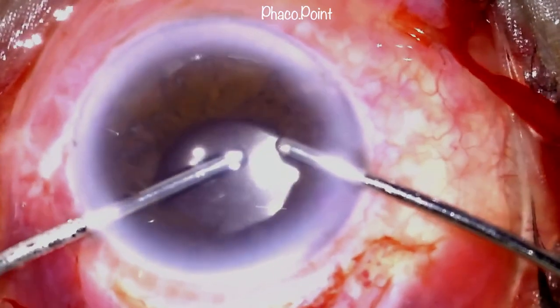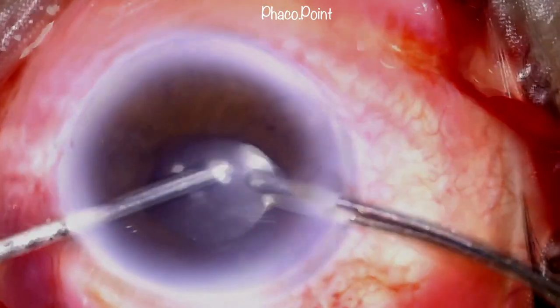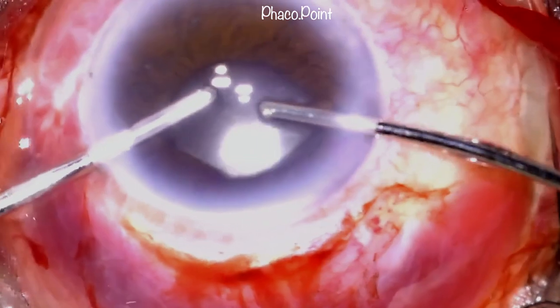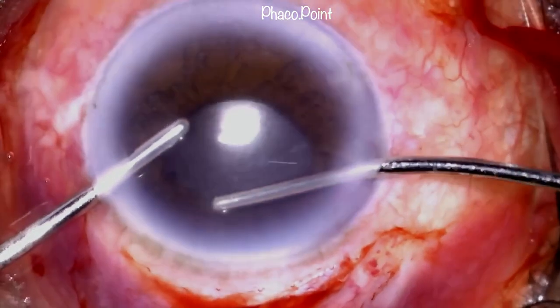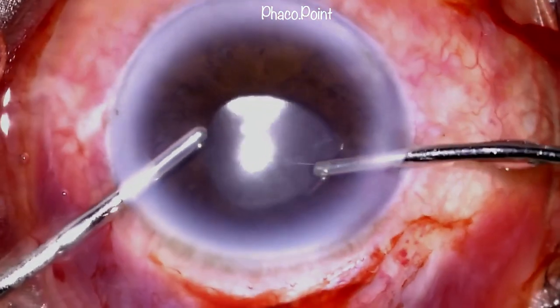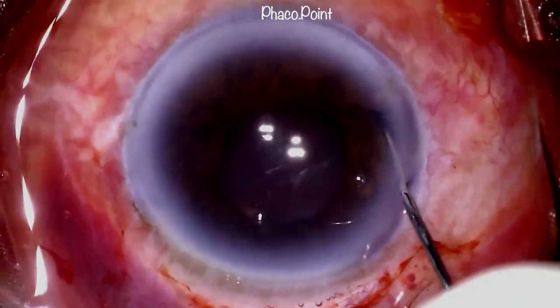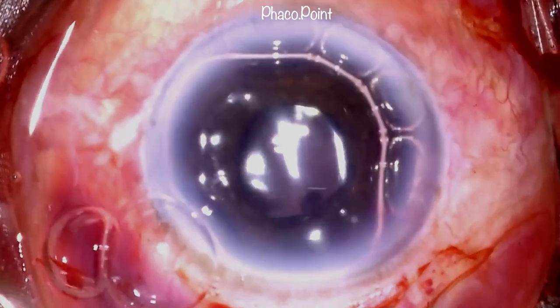The excessive viscoelastic from the anterior chamber is then removed using the bimanual irrigation aspiration. One has to take care that at this point you do not let any of the fluid go into the posterior segment, which has the potential of hydrating the vitreous and causing some more to prolapse. Intracameral pilocarpine is then injected into the anterior chamber, and this is followed by the introduction of intracameral air.